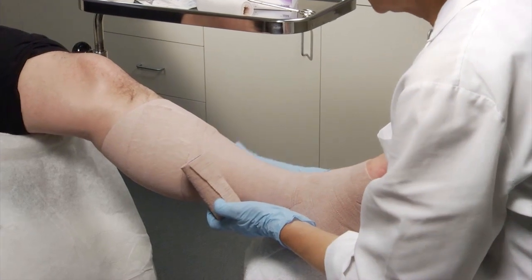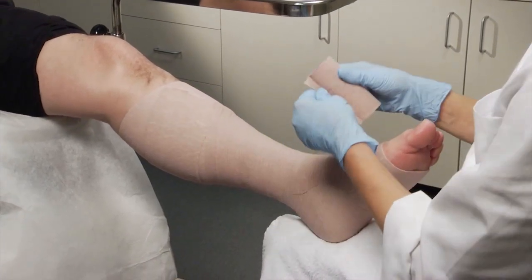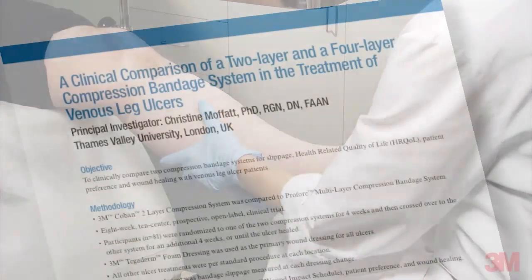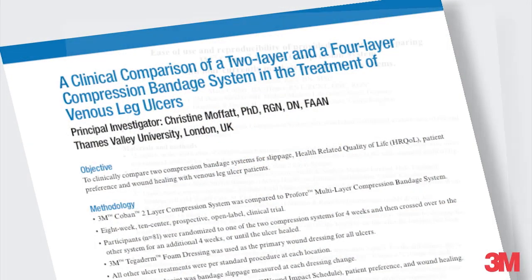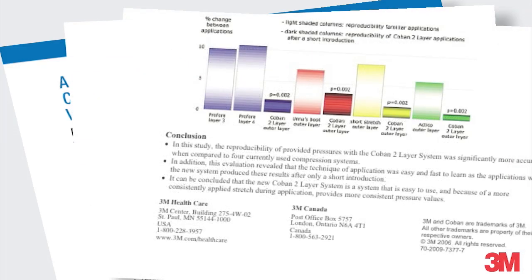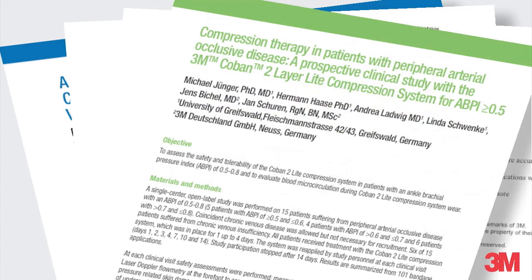Because the two layers cohere together, you may cut the materials and redirect the application to accommodate leg contours. Clinical studies have proven that this full stretch application results in a comfortable bandage that supports your patient's normal ambulation and provides sustained therapeutic compression.